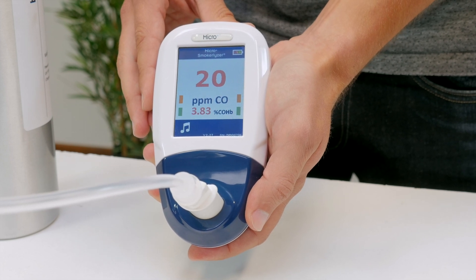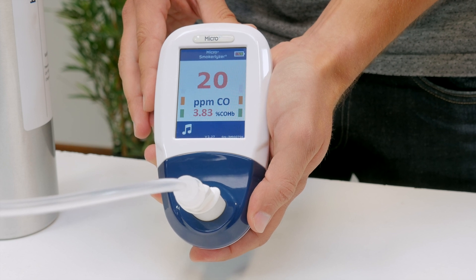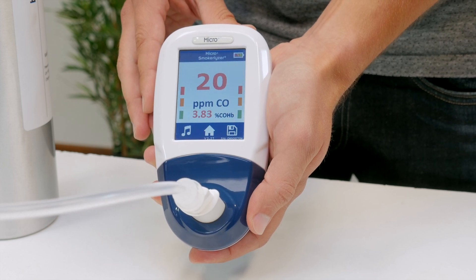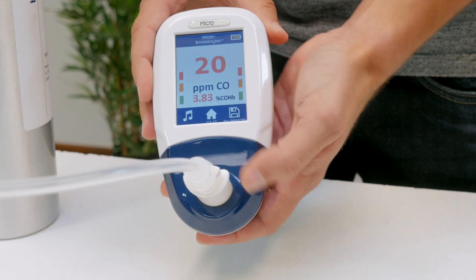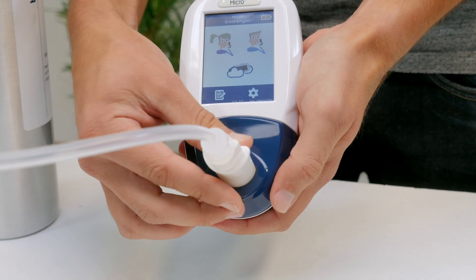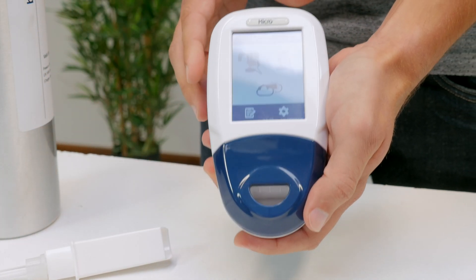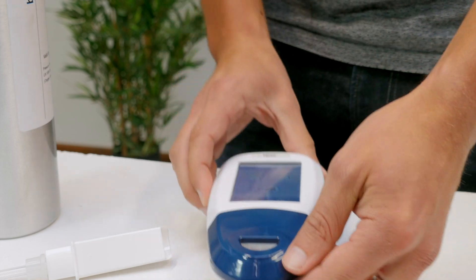If the result is between 18 and 22 ppm, then you need do nothing else. If the reading is less than 18 ppm or higher than 22 ppm, your sensor has drifted out of specification. To remedy this, you will need to perform a calibration.